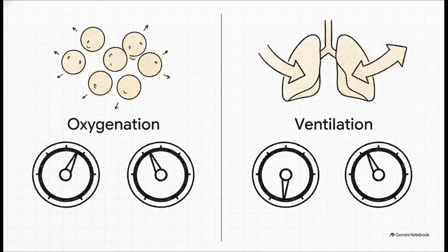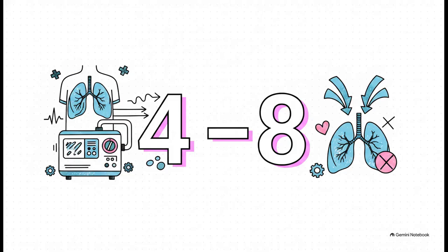On the other hand, you have your ventilation team, handling the carbon dioxide clearance: respiratory rate, so breaths per minute, and tidal volume, the exact volume of air delivered in a single breath. Oxygenation on one side, ventilation on the other. But here is where we absolutely have to be careful.